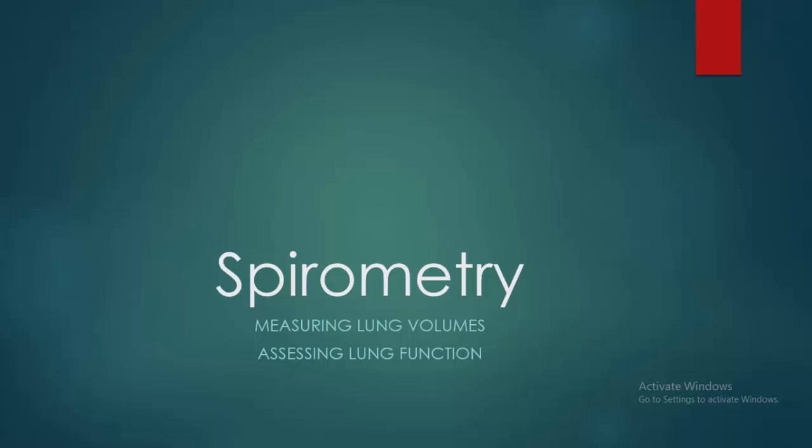This video presentation will deal with spirometry. Spirometry is the measurement of lung volumes, and the reason why you measure lung volumes is so that you can assess lung function, see whether things are normal, abnormal, or above normal. Medical assessment with spirometry, measuring lung volumes.